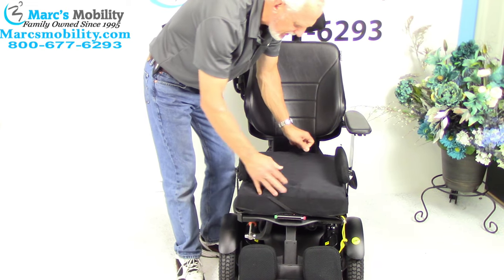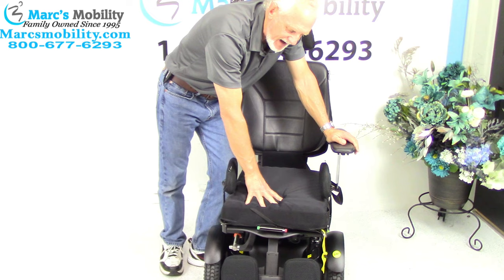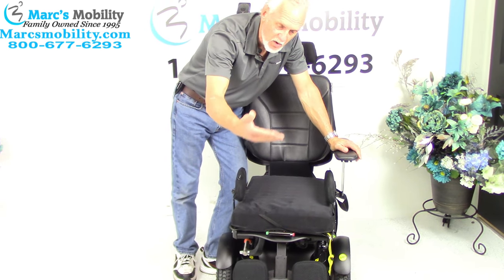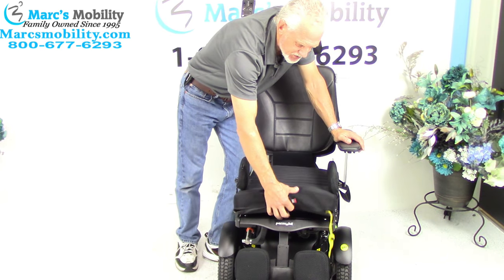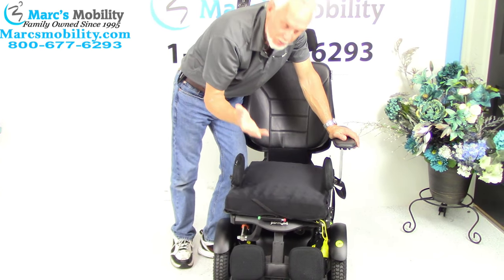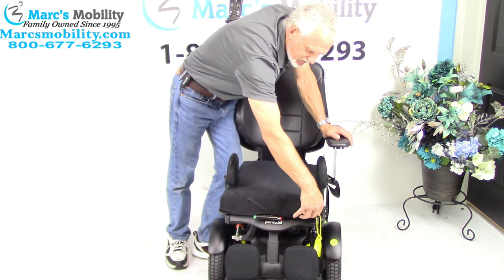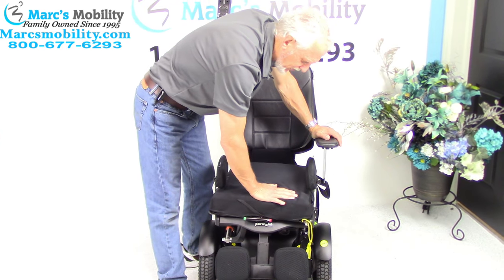This chair has what's called a 16-inch by 18-inch deep Roho cushion. This is an air cushion — one of the most expensive cushions you can get. But if you want to put your own cushion or you have a better cushion, you can just pull this cushion right off. The air goes through the valve right here — you unscrew the valve and pump the air with a little plastic pump which will come with the cushion.